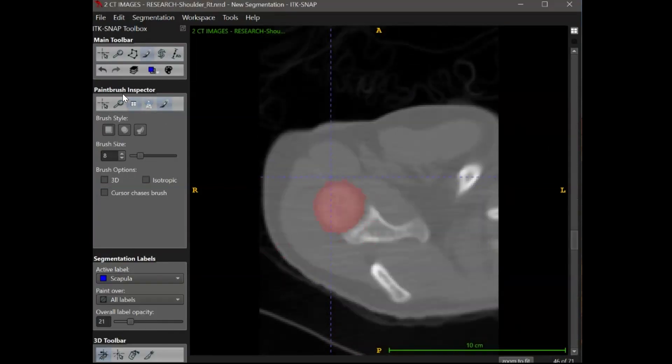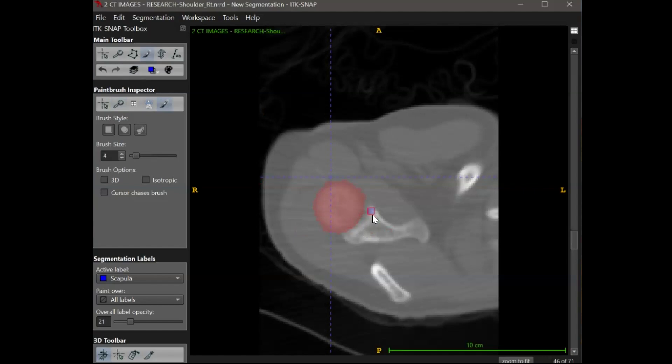For your first segmentation lab, you only need to segment one anatomical feature. However, it is possible to add in multiple segments. So if I want to, I can create another segment of the scapula with the blue scapula label that I created.